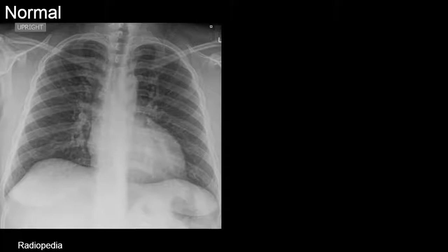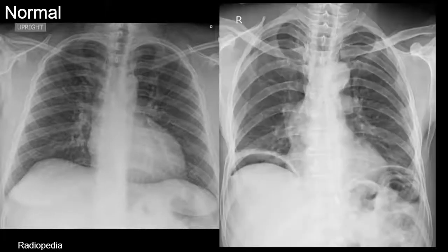Here's another example of a normal chest radiograph and you can see the upper abdomen here. There's no free air under the diaphragm, so on a chest radiograph we can often see abdominal findings as well.